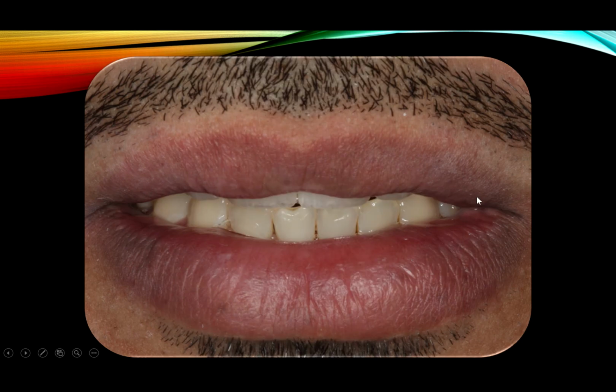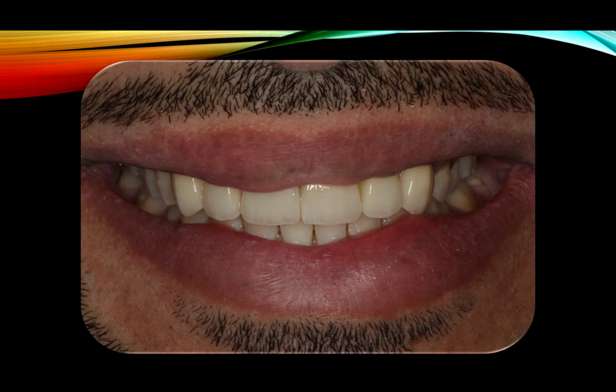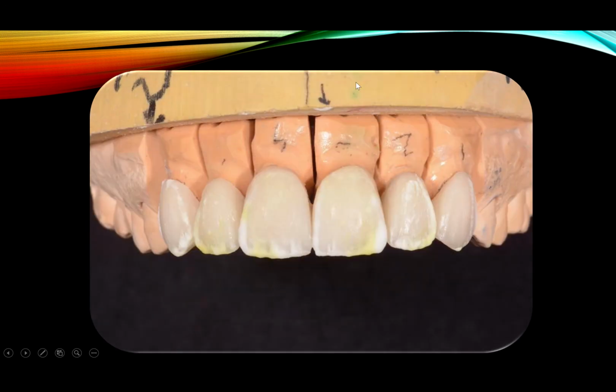First of all, let me show you the case in the patient's mouth. All right. You see, no matter how long you make these teeth, you barely can see anything in the freeway zone. But anyway, with smiling, you can see a bit more. Anyway, that's not my concern. My question is, how was it made? Was it monolithic or layered? This is how it was made. I'm sorry for all the scrap here and there, but anyway.